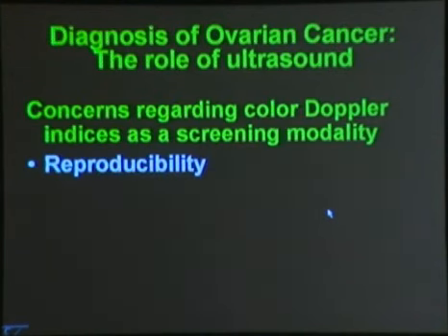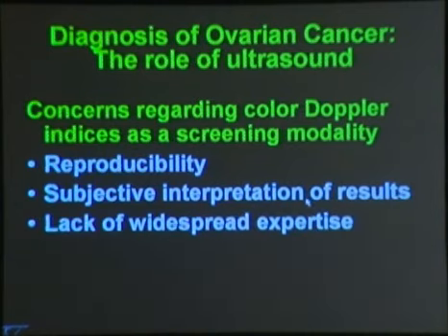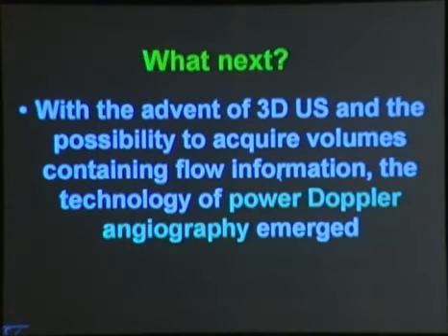And once again, even though you will have a lot of questions about the role of Doppler lately, because there is poor reproducibility, lack of expertise, lack of equipment, variability in looking the results, you can then do angiography. And I showed you already what is done, and that was done before. I will not go back.